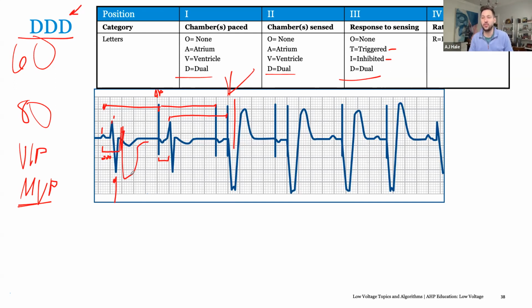But as you said, you have these patients with complete heart block. They're not going to be conducting much. So we are going to be tracking the atrium, but we'll probably keep our AV delays short if we know they're not going to be conducting. I'll keep it at 200 milliseconds. I'll keep it at 180 milliseconds. And then I'm just going to pace no matter what, because we know there's nothing intrinsic going to be breaking across, but we still want to maintain that atrial synchrony and also regulate the heart rate based upon demand. If the patient's exercising, their heart rate's going to go up, and we want the device to follow that. We don't want to pace them at 60 beats a minute all the time. Does that make sense?